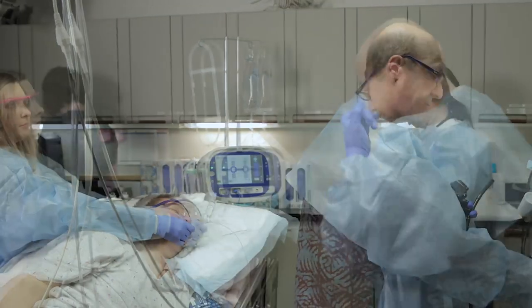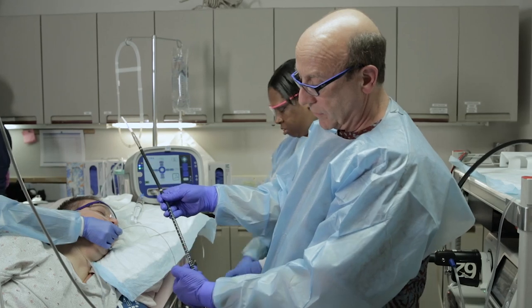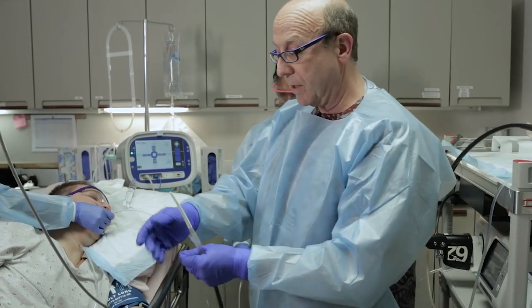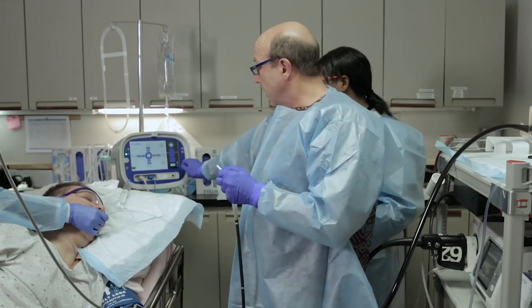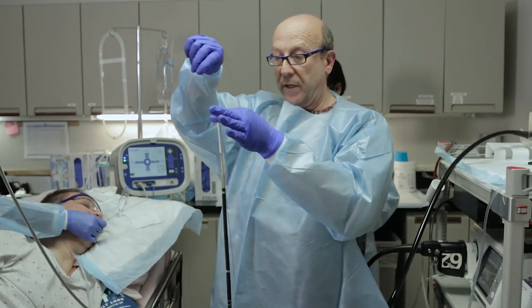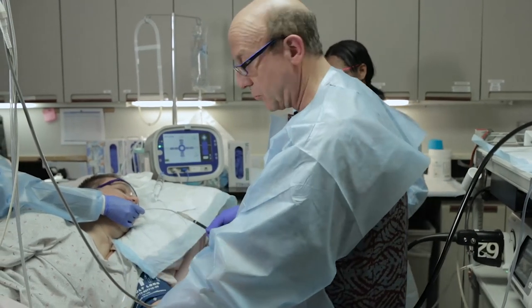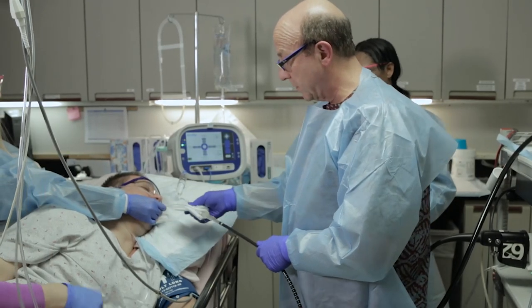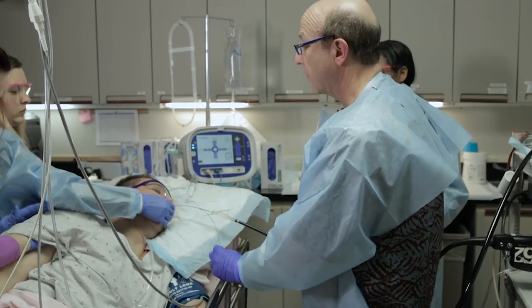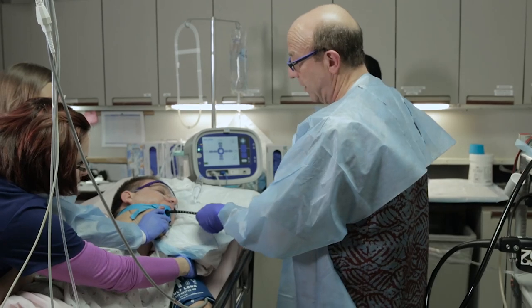While we were measuring, the technician has gone ahead and put a red mark at the level of the z-line, so for visual purposes it's easy to document where we are and helps us measure the different positions. She's also placed that number on the screen. We'll place the wire through the center of the Stretta catheter and pass it down into the patient to begin our treatments, using a very small amount of lubrication on the wire and catheter to facilitate passage — not too much, so it doesn't get gummed up in the back of the patient's throat.